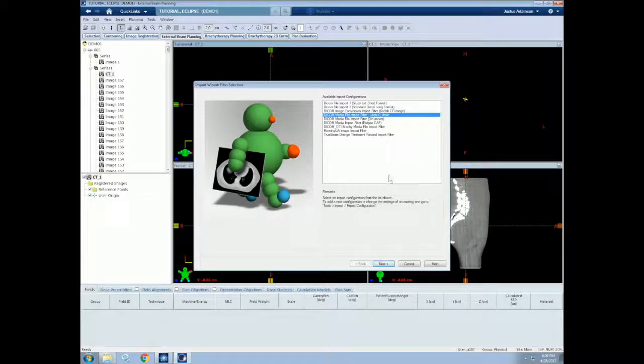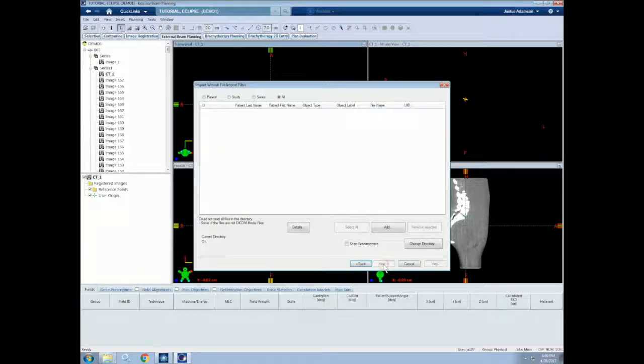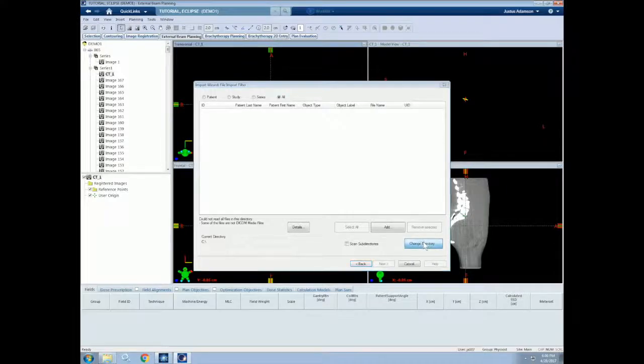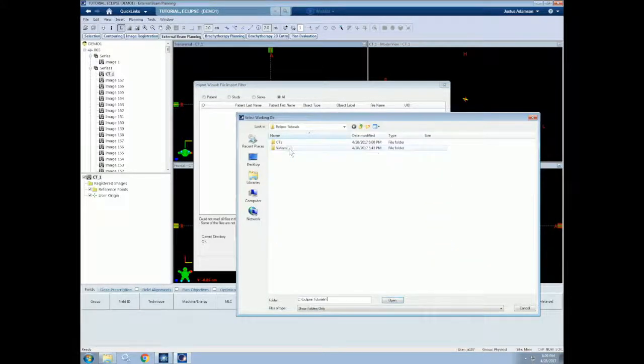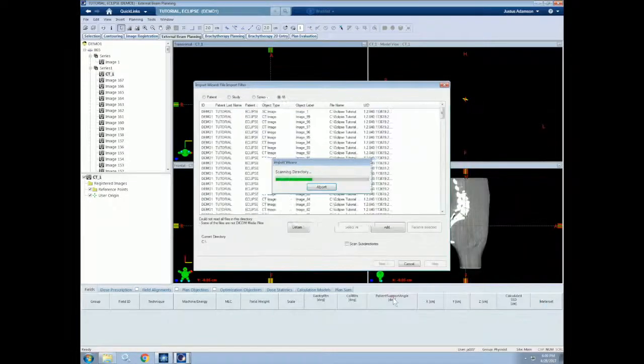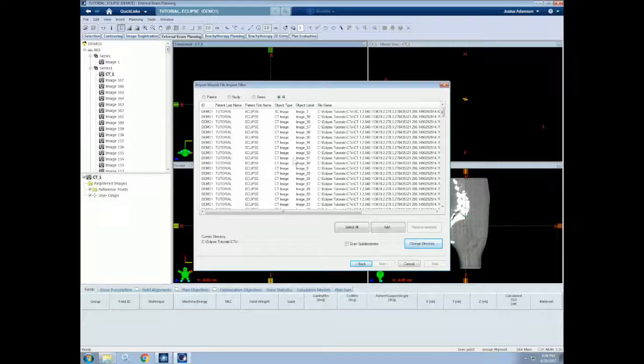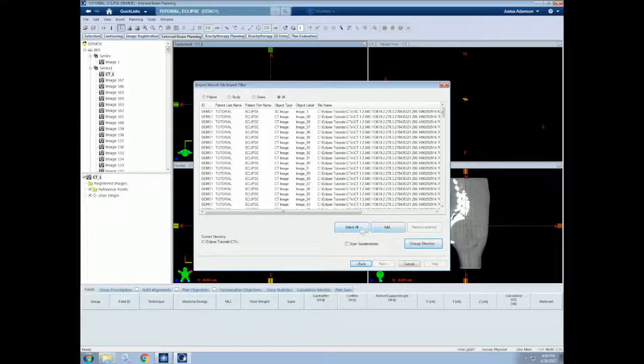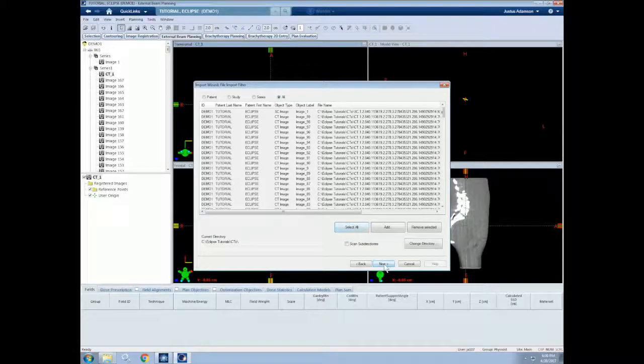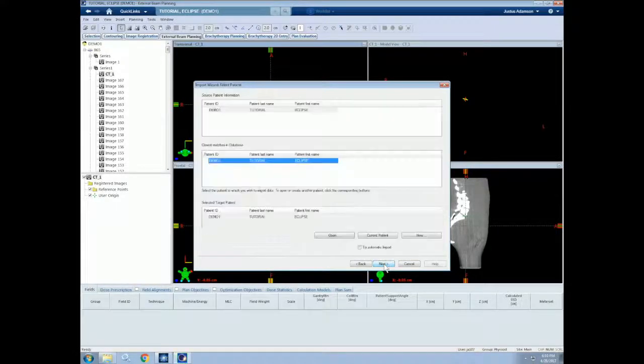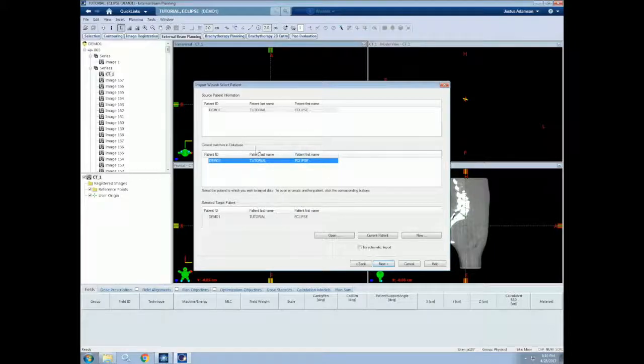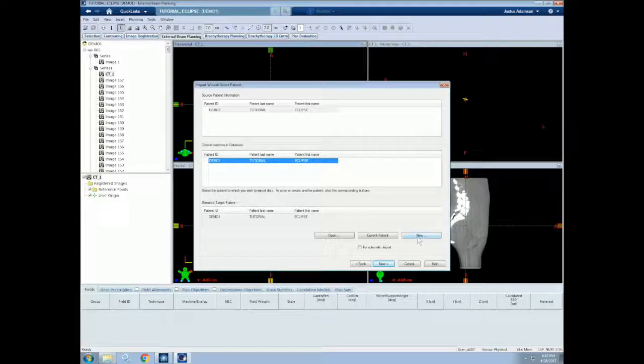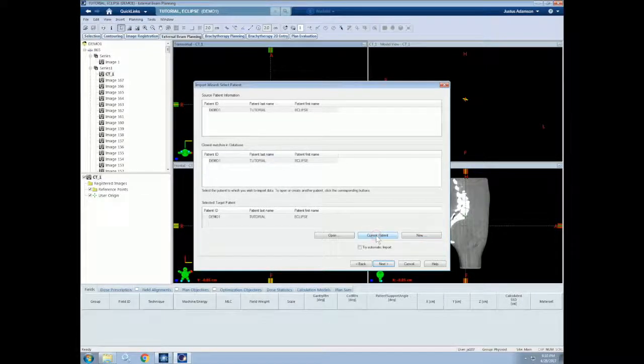We can now select the directory that we would like to look in. We can then change the directory to a specific folder that we are interested in. We'll open that folder and then all of the CT images in that folder will pop up. We can select all and then go to the next step. We can now select the patient that we would like to put these images into. As we did before, we can select a new patient or we can just do current patient, which is the one that we have open right now.